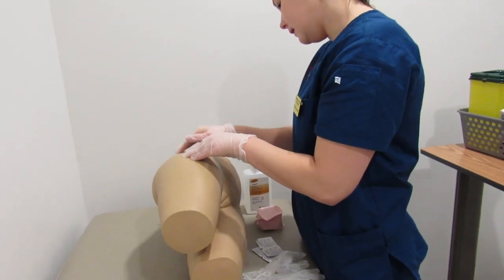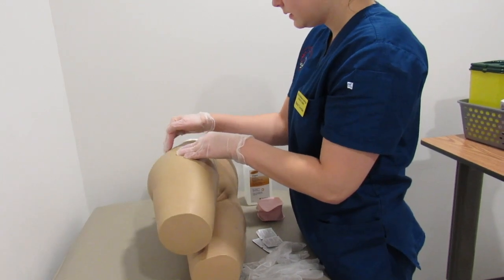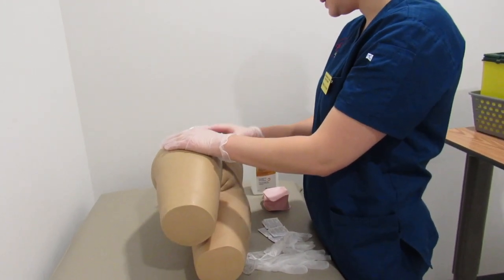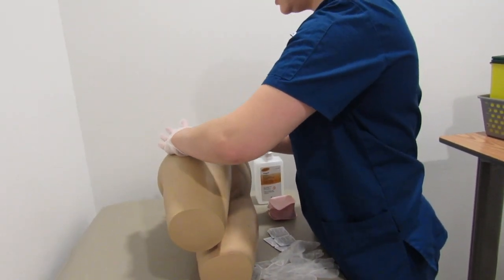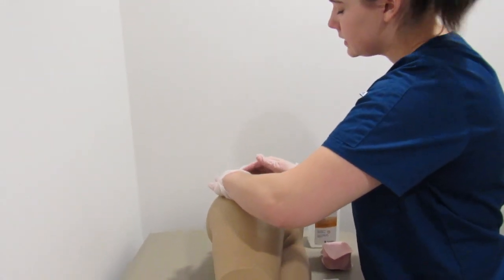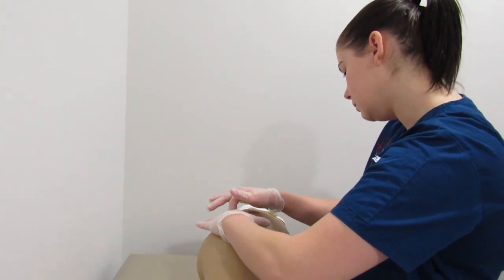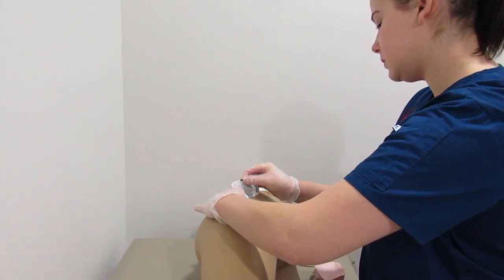I'm just going to palpate along the area. Do you feel any tenderness or numbness? Any tingling? No? Okay. So now I'm just going to be landmarking where I'm going to inject the site. So I'm going to place the palm of my hand on the greater trochanter, my thumb towards the groin, my index finger towards the anterior superior iliac spine, and then my middle finger down towards the buttocks to make a V shape, and I'm going to be injecting right in between those two fingers. Now I'm just going to swab the area.